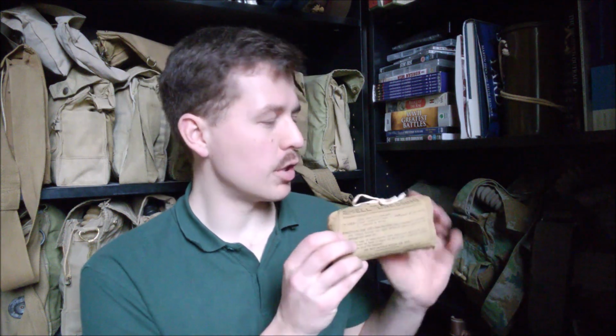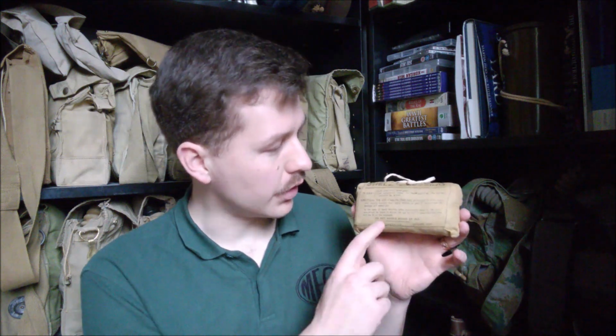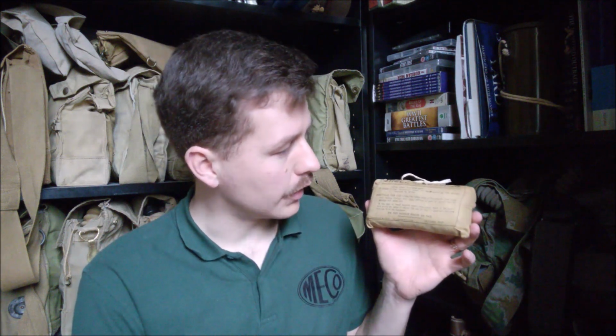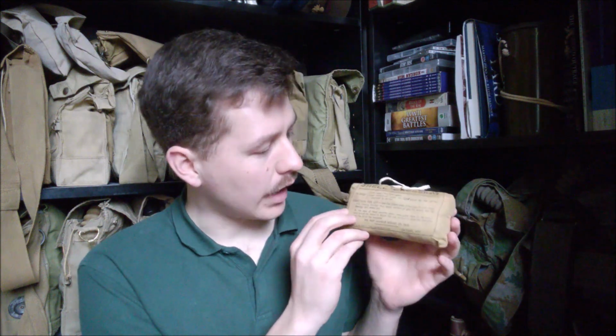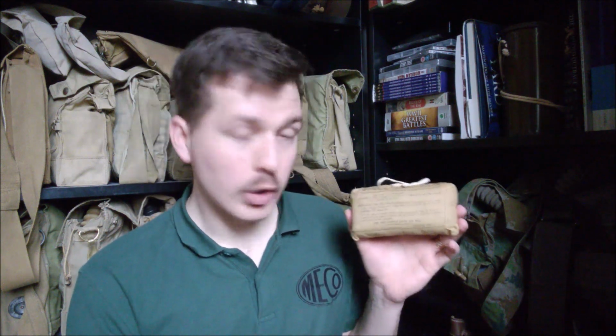The design was first introduced, as far as I'm aware, in 1916. It was modified slightly in 1917 with the inclusion of an iodine ampule in a small cardboard tube inside the packaging. But this had disappeared by the Second World War. The design stayed essentially the same and was not only used by the Army, but also by Civil Defence, so the Home Office contracted for these as well, the Admiralty and the Air Ministry. In fact, I have an Admiralty example here.